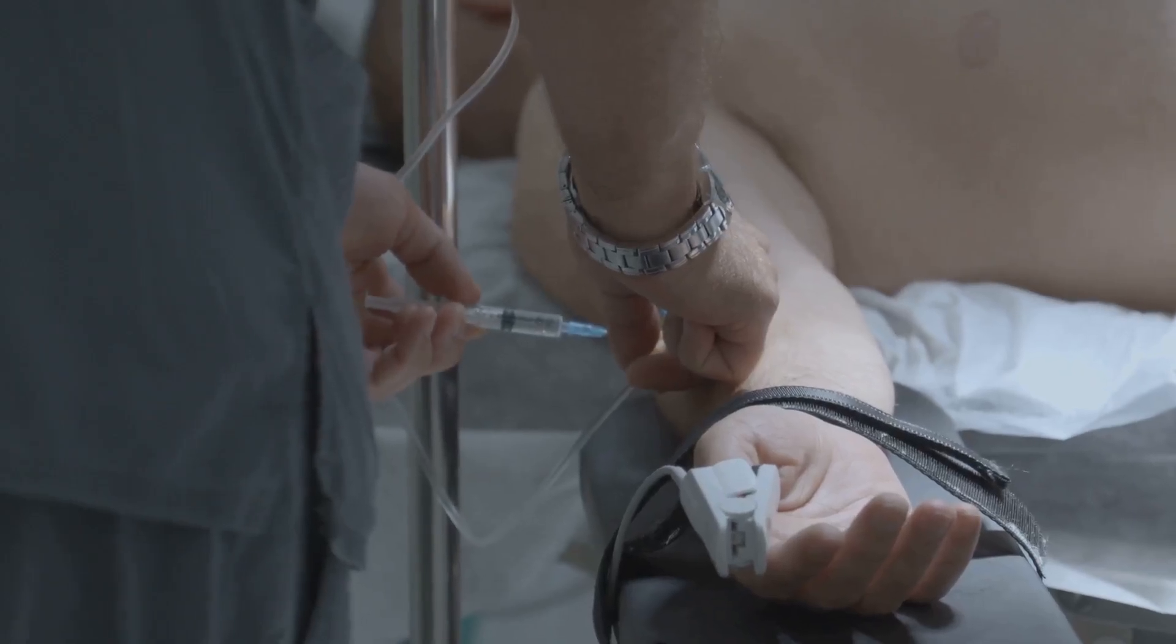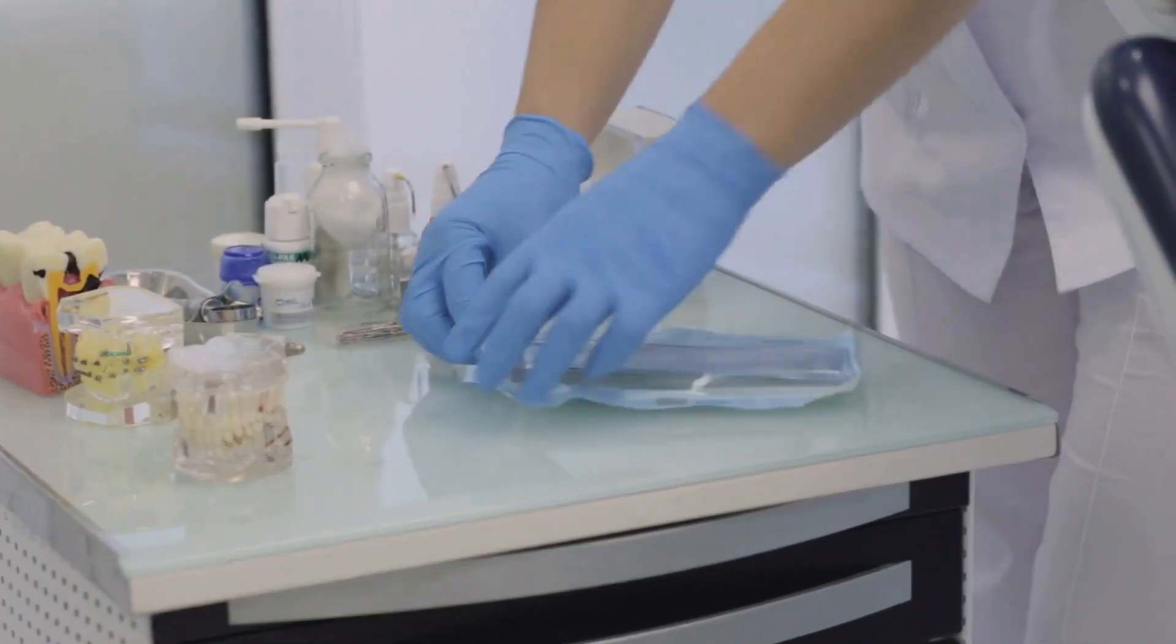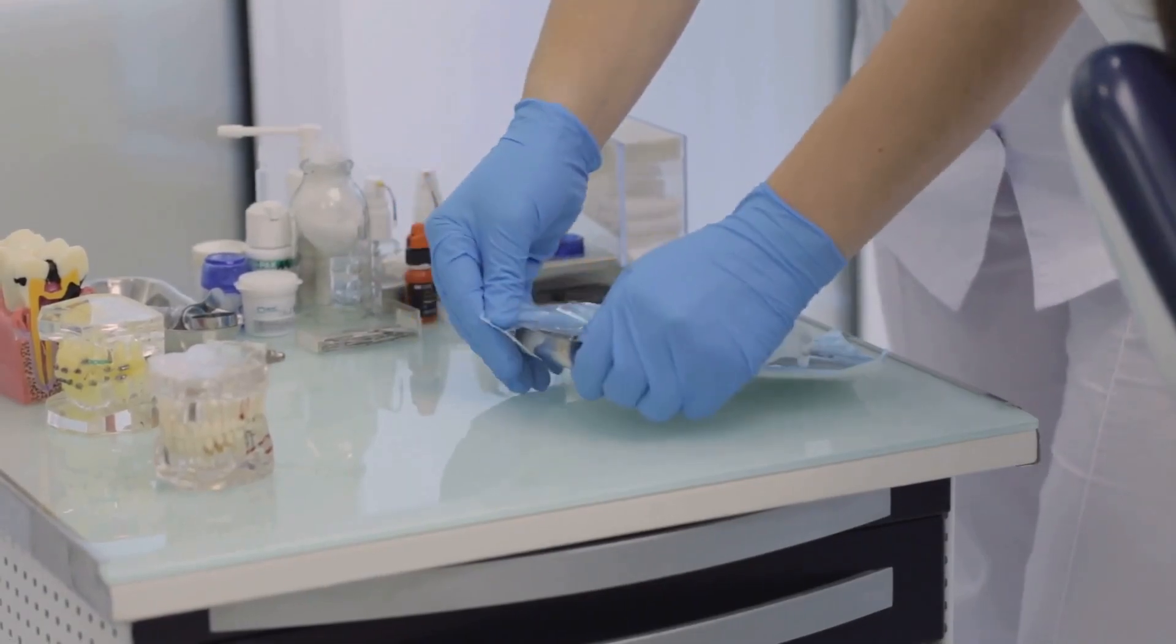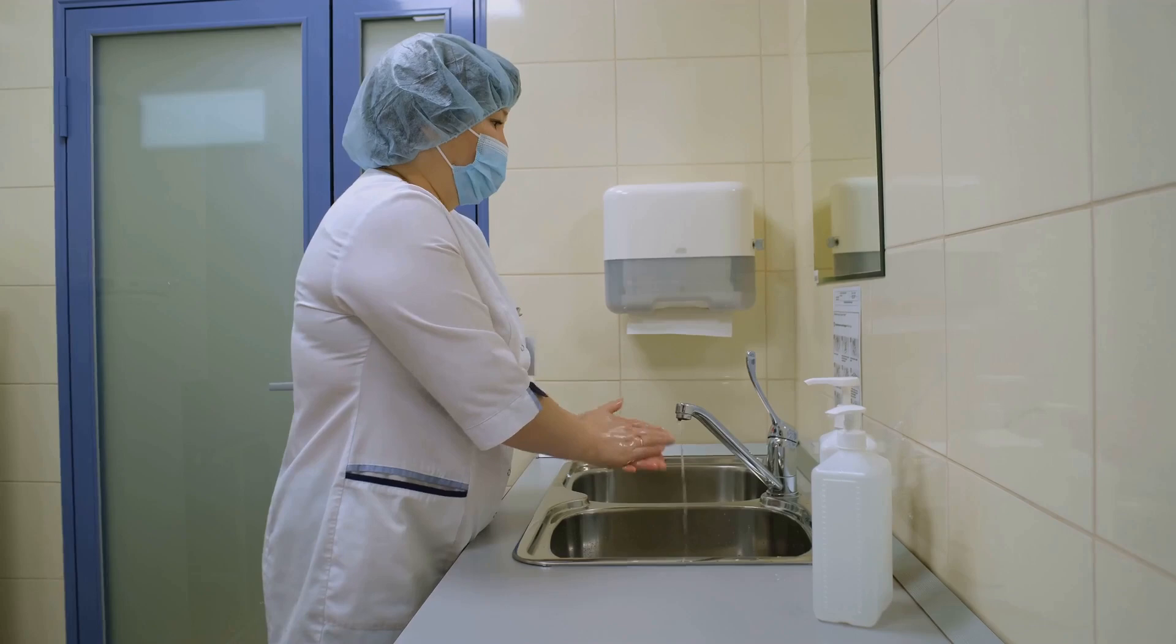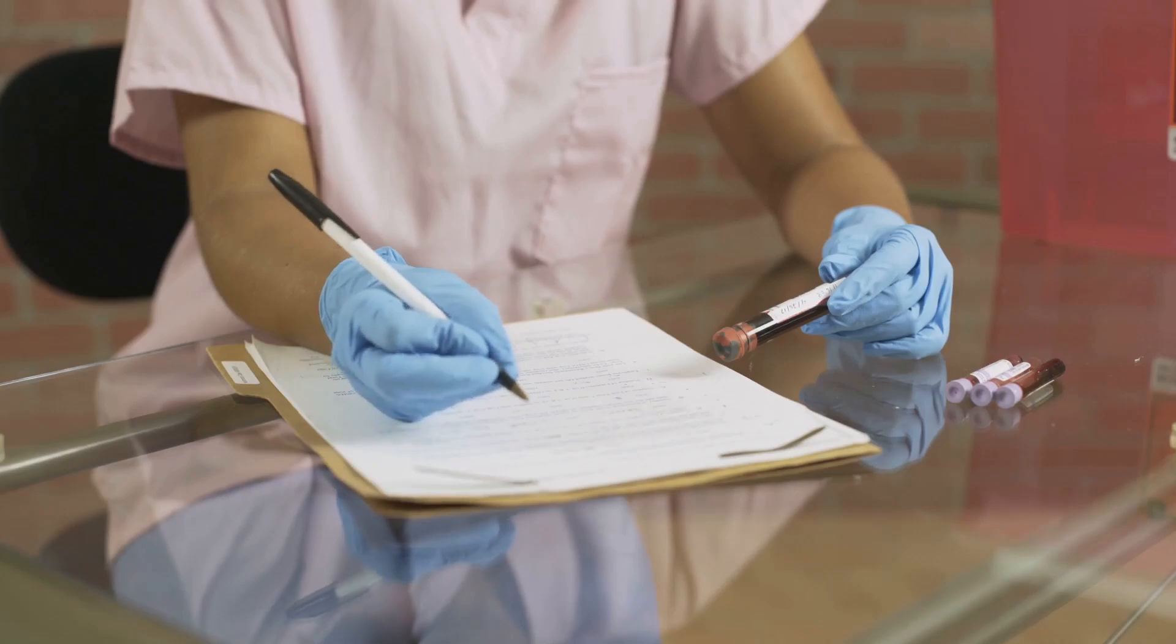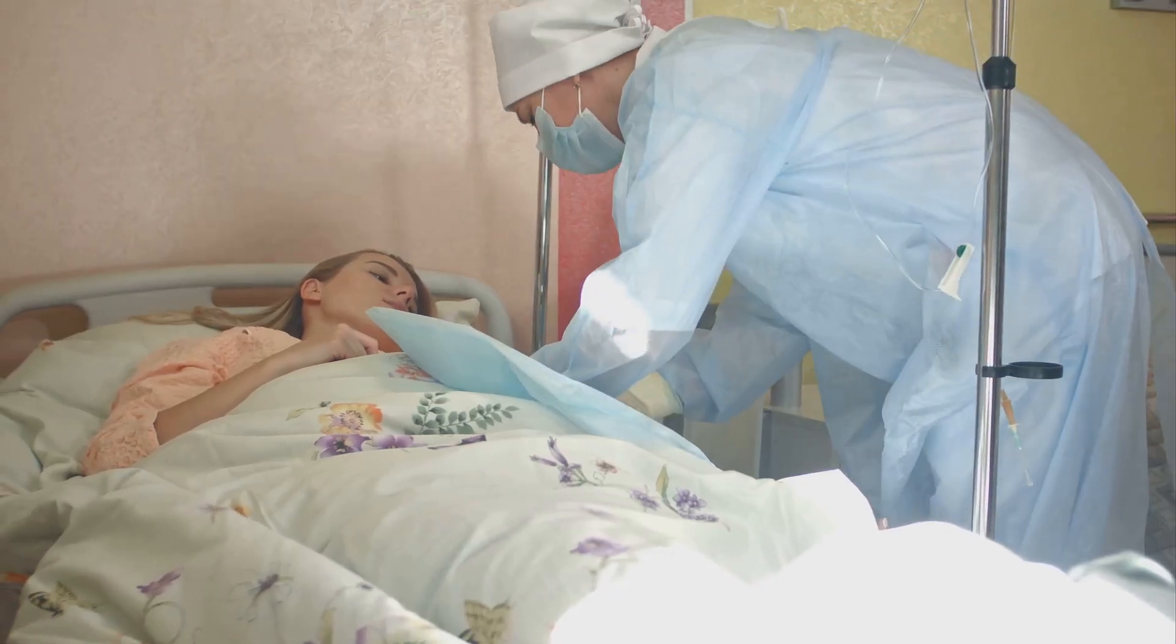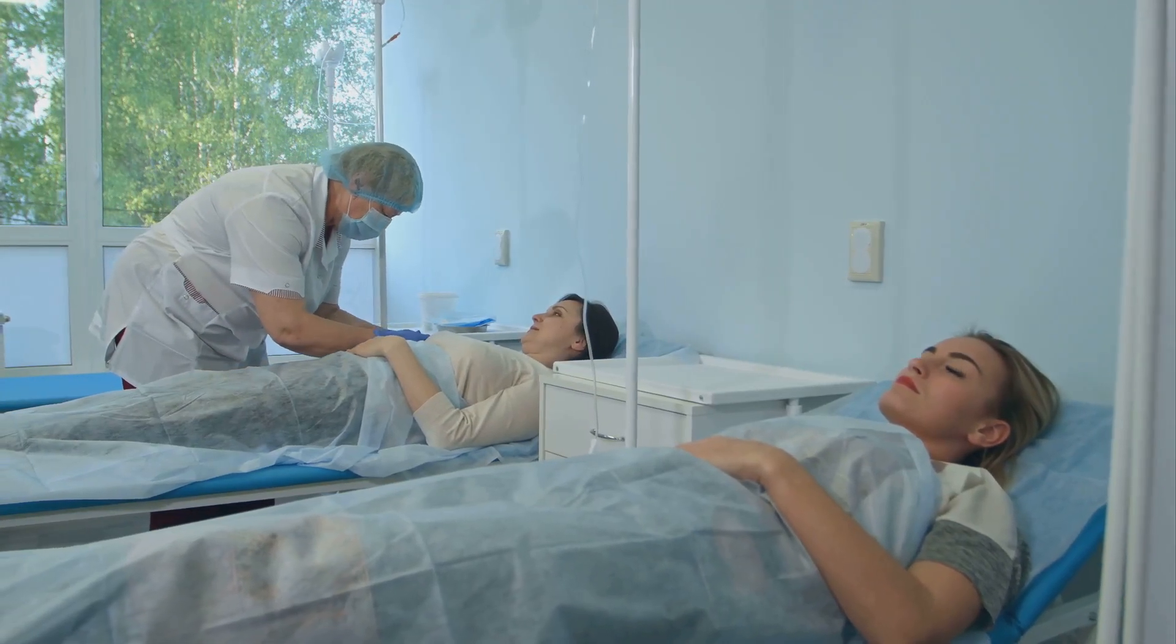Then there's the tourniquet, your best friend when it comes to finding those sometimes elusive veins. Don't forget the antiseptic wipes for cleaning the area, gauze pads for dressing the cannula, and a sharps container for safe disposal. Preparation is key. Always wash your hands thoroughly and gather all your equipment before starting. Check the patient's notes for any allergies or previous issues with cannulation. Explain the procedure to the patient and get their consent. Remember, a calm and confident approach can make all the difference.